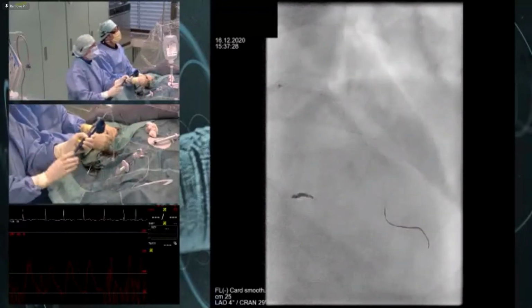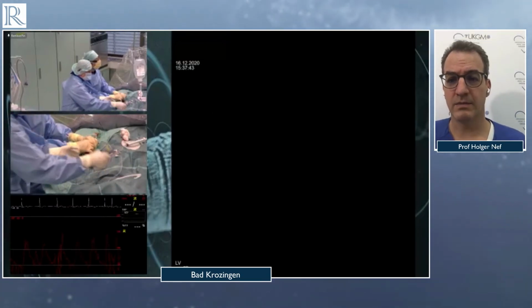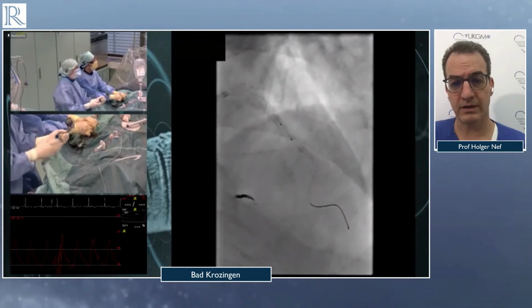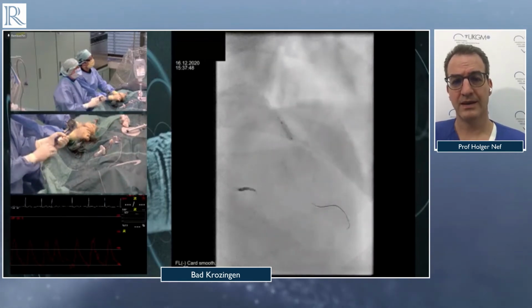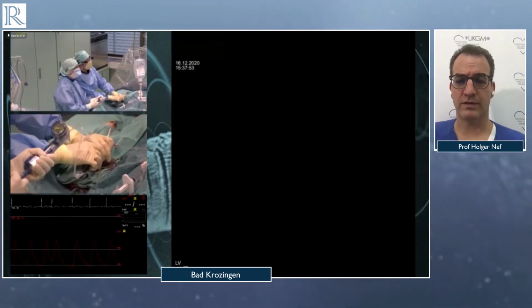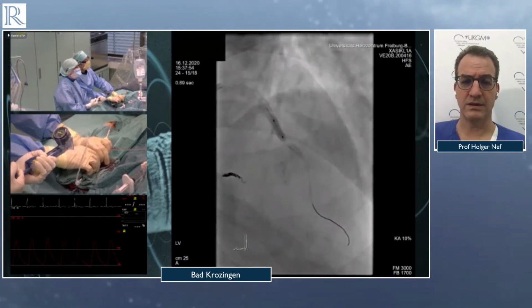You are completely right. So we have seen, interestingly, the number of pulses were less in the eccentric in comparison to the concentric lesion in the sub-analysis, but nevertheless, we do not have the information in these kinds of retrospective analyses of the OCT pictures.